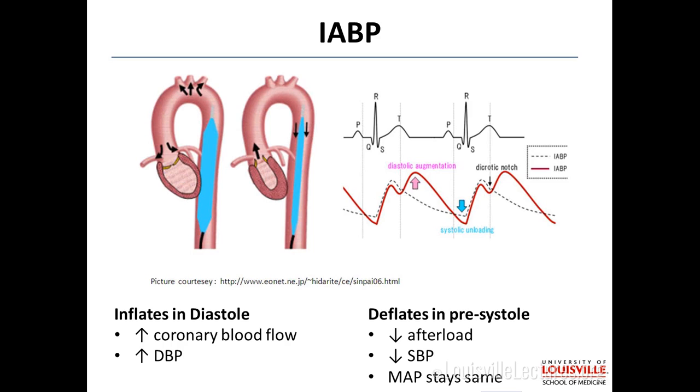In general, if you have a very bad aorta, so lots of atherosclerotic disease, either at the aorta or at the femorals, it could be hard to get this in, and you don't really want to be crushing against a very atherosclerotic aorta. So that's a relative contraindication. And then what about if you have an aortic dissection? Would this be a good way to afterload reduce the heart? No, bad idea. You're just going to propagate the dissection. So those are the main contraindications to balloon pump.